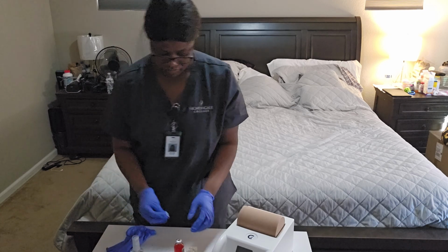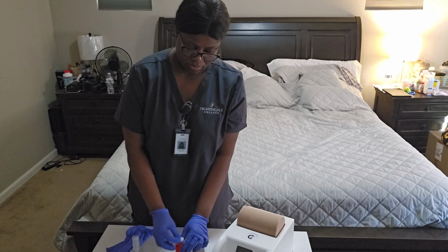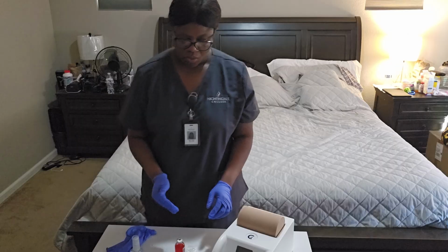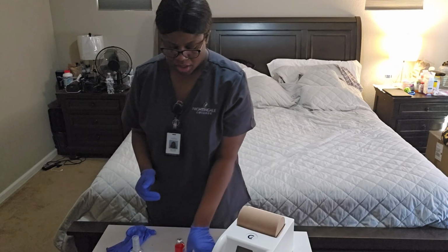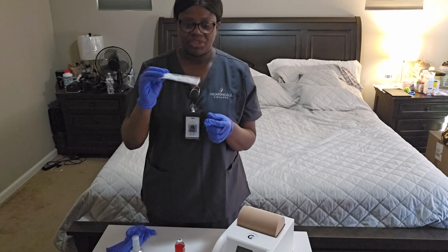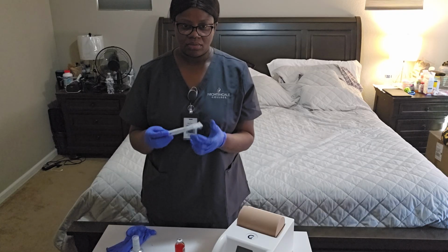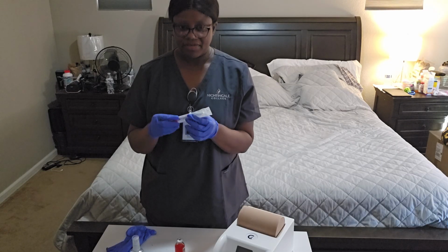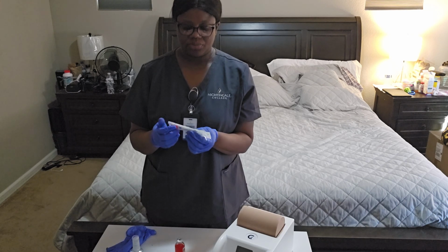I'm going to dispose of this. I'm going to clean this with an alcohol swab, dispose of this, and leave this to air dry. While this is drying, this is my syringe. This is a 1 ml syringe, 25 gauge, 5/8 inch needle.